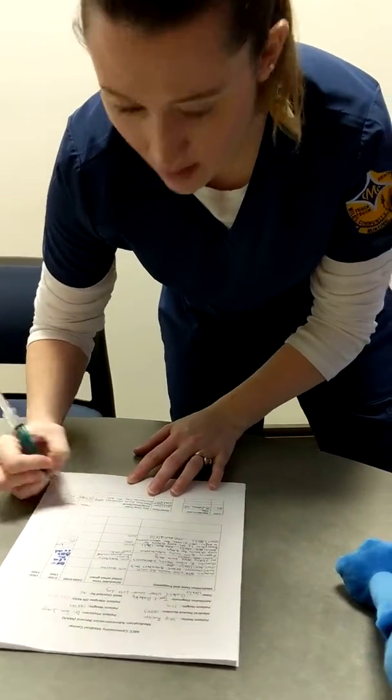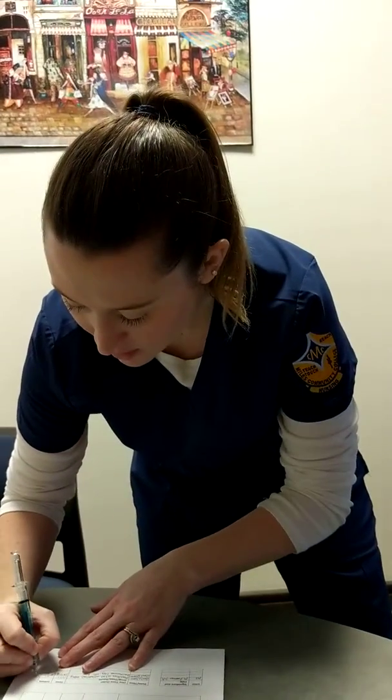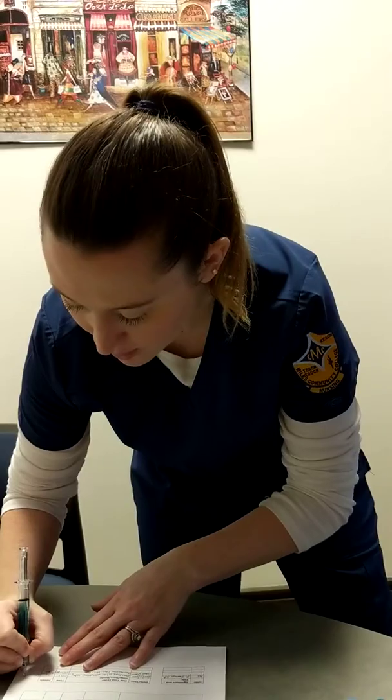0830, initials, and I'm going to document that we gave it into his left forearm. That way, whoever gets to see Mr. Skip in 48 hours, Skip, you're going to need to return in 48 hours so we can check this spot. They know where to look for a reaction site. They should still be able to see my marking, the pen marking of where the injection was given, to see if any redness has spread or if there's any bumps or bruises or anything like that.